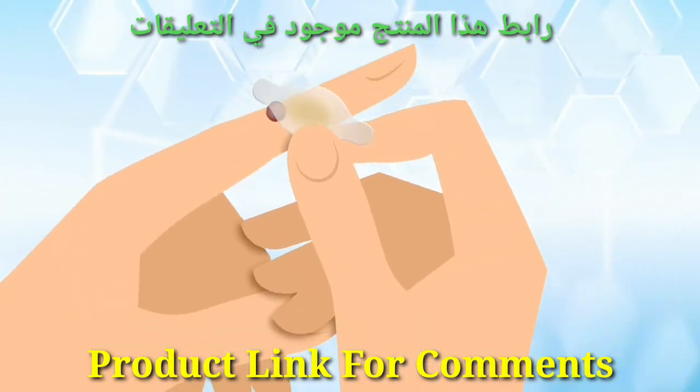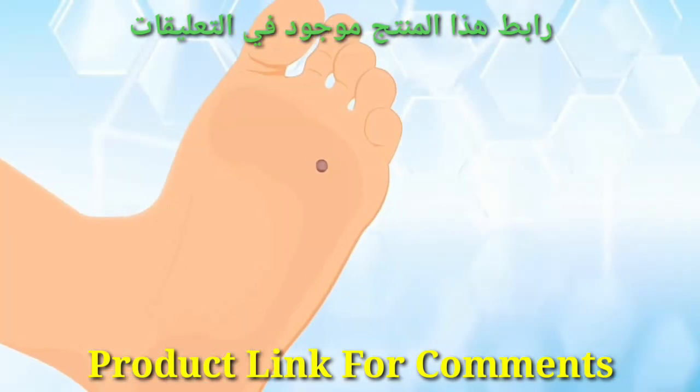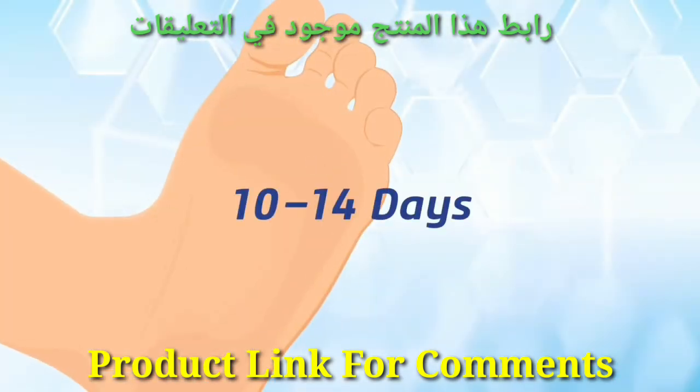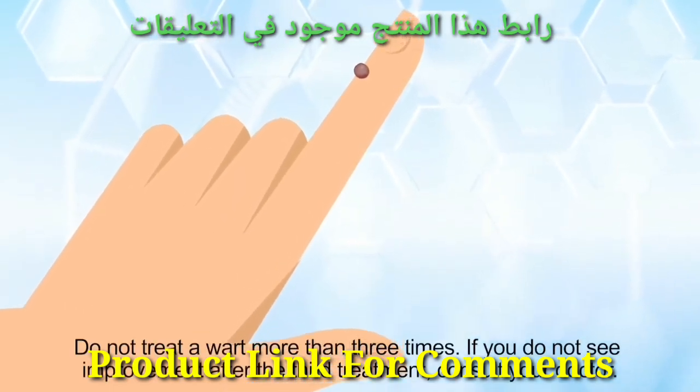Cover the treated wart with the enclosed gel pad for added comfort and protection. For most people, the wart should fall off within 10 to 14 days. If the wart hasn't diminished after 14 days, repeat Steps 1 through 3.